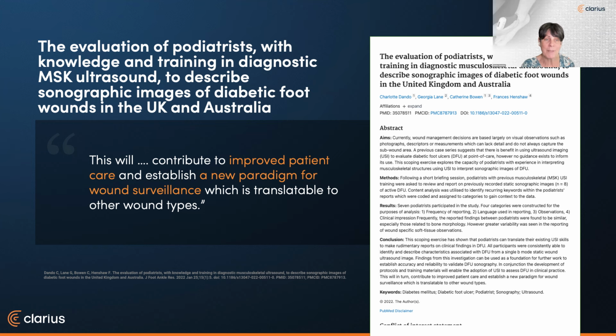And on the next paper, although we won't be covering this topic specifically, I found this interesting in that it shows the expanding uses for ultrasound in the podiatry world. The authors found that the podiatrists with ultrasound experience were able to identify and describe characteristics of diabetic foot wounds. And this may translate into the development of protocols and training material for further use of ultrasound in this application, as well as other wound types.